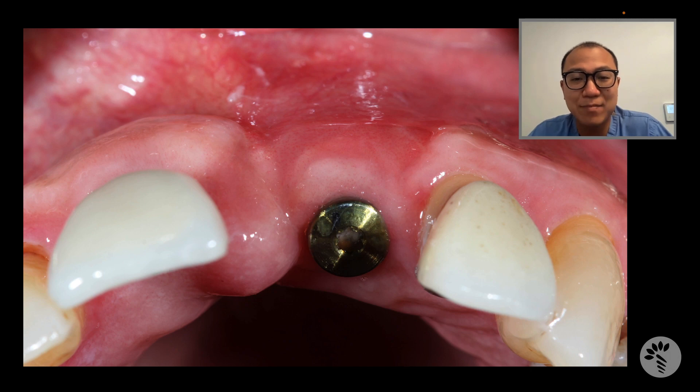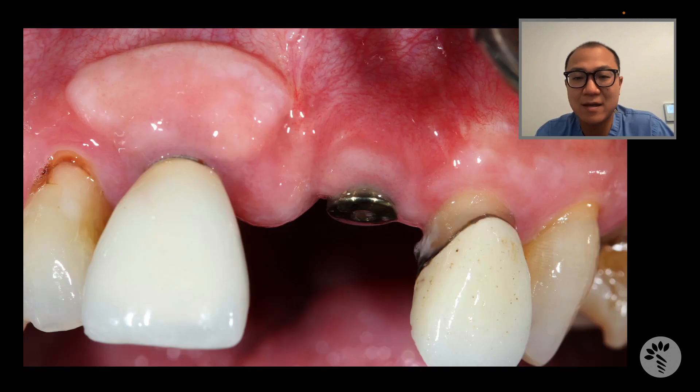We already placed the implant on the maxillary left central incisor area, and this is how we present it. The implant is almost ready to be restored, and when you look at his case, he already had an implant on the contralateral side.